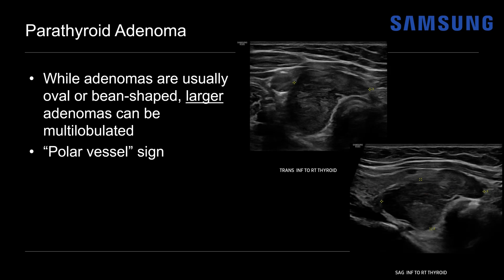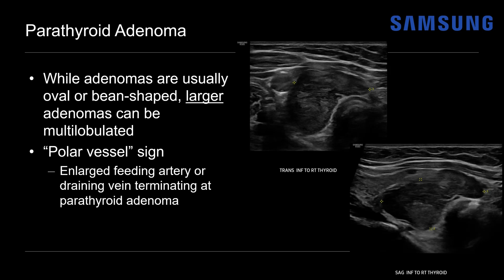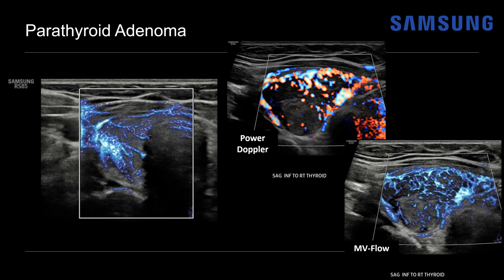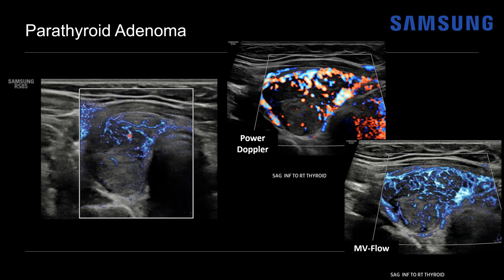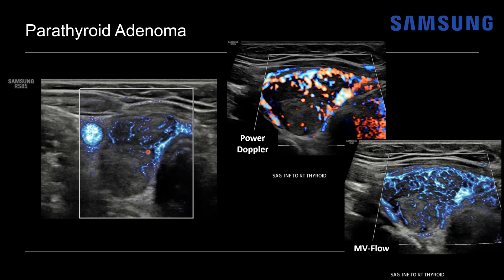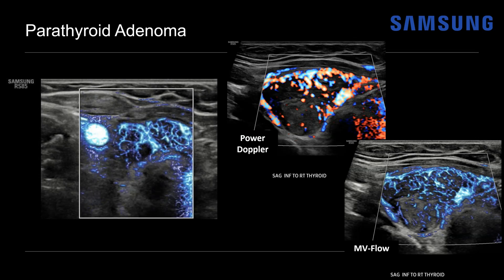Another finding that can be seen is the polar vessel sign — often described on CT but can also be seen on ultrasound. That's the presence of an enlarged feeding artery or draining vein terminating at the parathyroid adenoma. Returning to those flow images, we can see the flow throughout the large parathyroid adenoma is somewhat coalescent at the margins, which may represent a polar vessel sign. On this real-time image, here's the normal thyroid compared to the hypervascular parathyroid adenoma — you can see just how hypervascular that adenoma is. Quite impressive and typical for these larger adenomas.